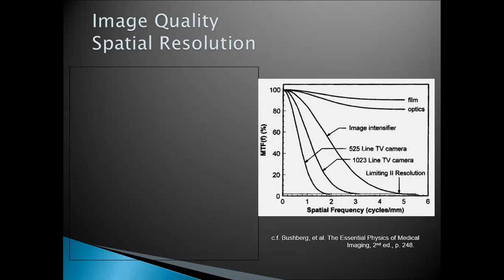Look at this object, but look, the MTF reduces as the spatial frequency increases. What do we mean by this? Okay, we look at a spatial frequency of 1. What does it correspond to? Let me draw that on the board and see how we can make a little.